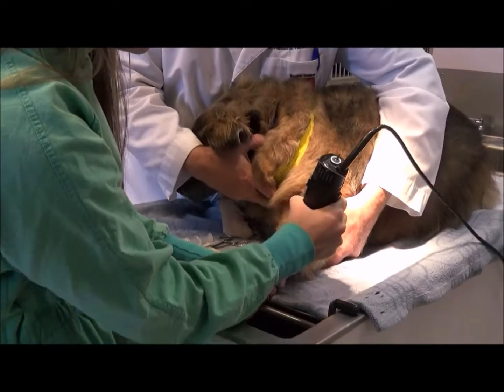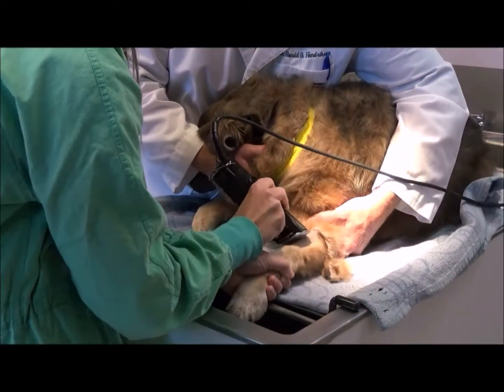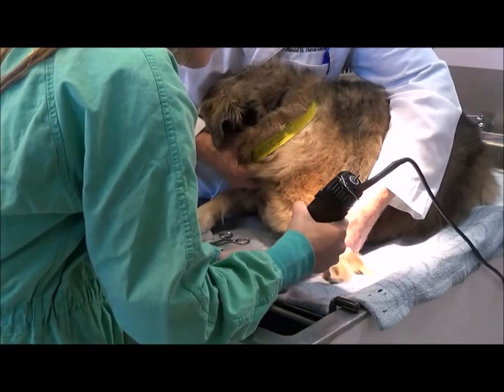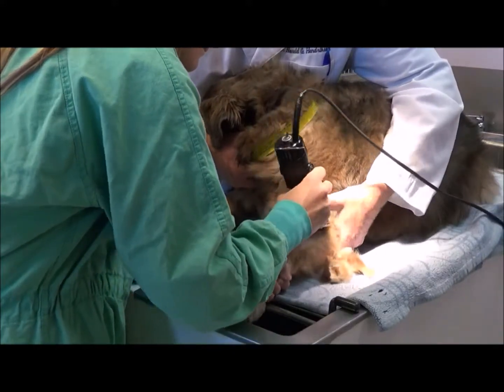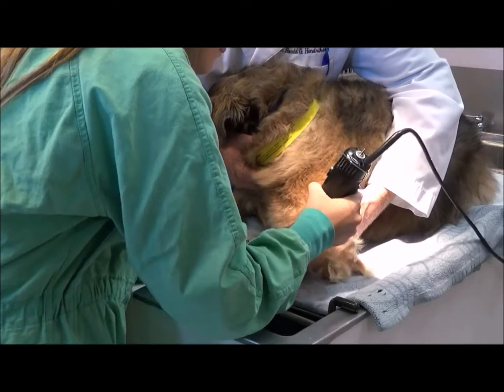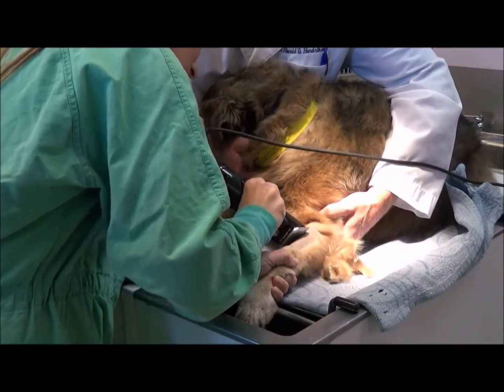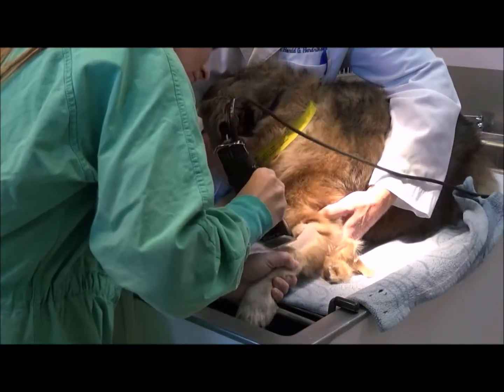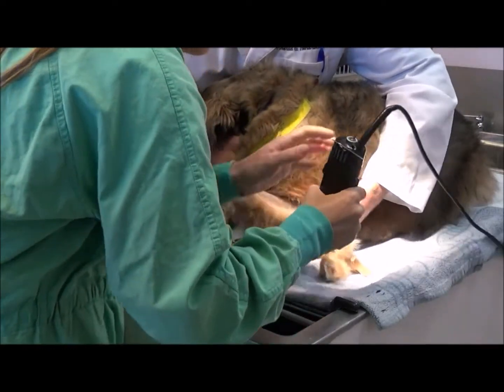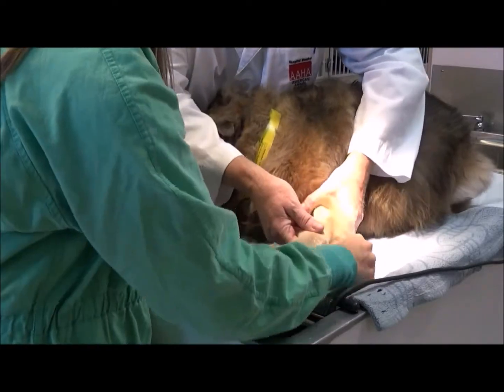You want to clip all of the hair that's going to come into contact with the IV catheter or any of the catheter components. Just be sure to get all the hair out of the way, out of the area.